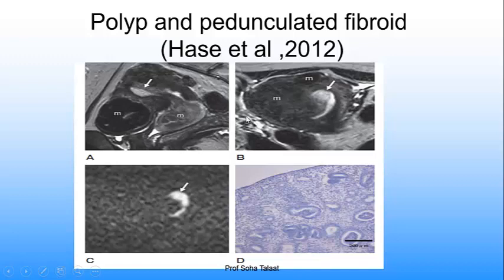This is a polyp and pedunculated fibroids. Again, how to differentiate. This is a myoma. When you find multiple myomas, I am more with fibroid, and this lesion is not so low as the other myoma, but usually the pedunculated fibroids are edematous and may undergo degeneration also.